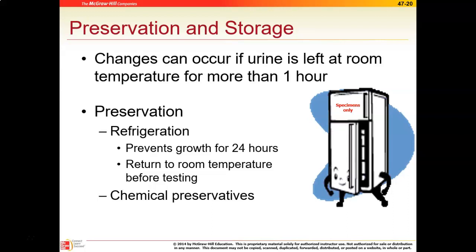If you do put it in the refrigerator, it's important to make sure you let it return to room temperature before you start doing your test analysis. And it is normal that the longer the urine stands, sometimes the cloudier and the more crystalline material you'll actually see form. And so sometimes the characteristic of the urine will change a little bit the older it gets or the longer it's in the refrigerator.